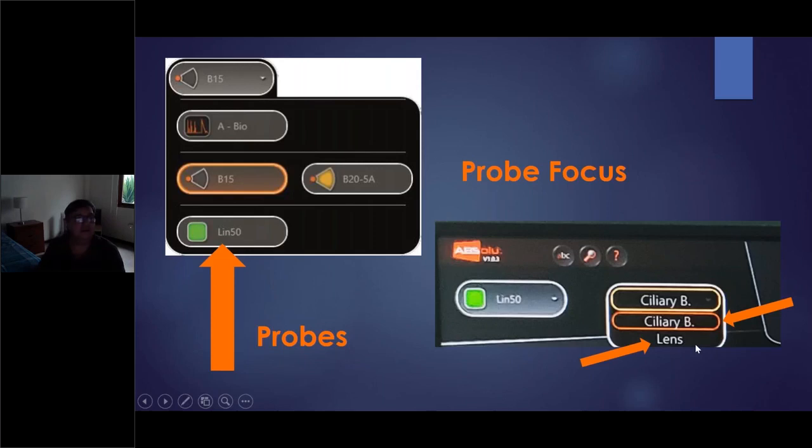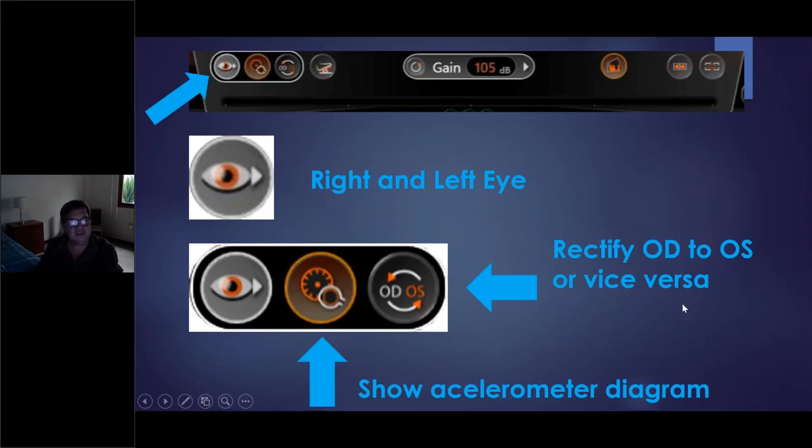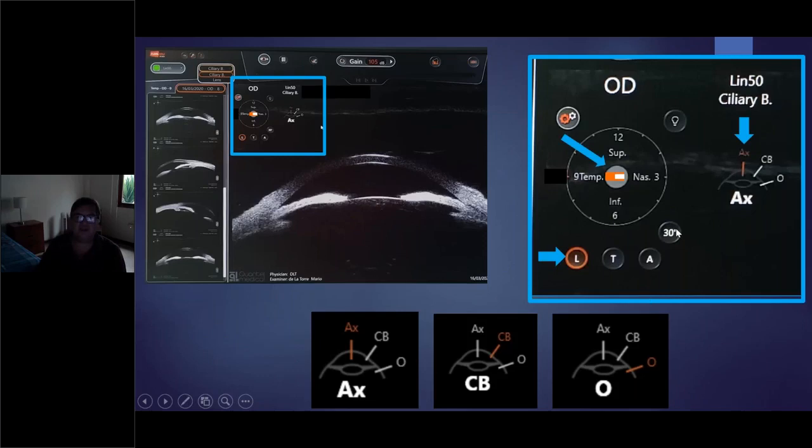And then I have the parameters of the right eye or the left eye, I can choose it. I can rectify only to left eye or to right eye or vice versa. And I can show or not show the accelerometer diagram. Then this is the accelerometer diagram. And when I put it, the machine reacts immediately and shows me the position. This is an axial, longitudinal, with the ciliary body focus, the linear 50.